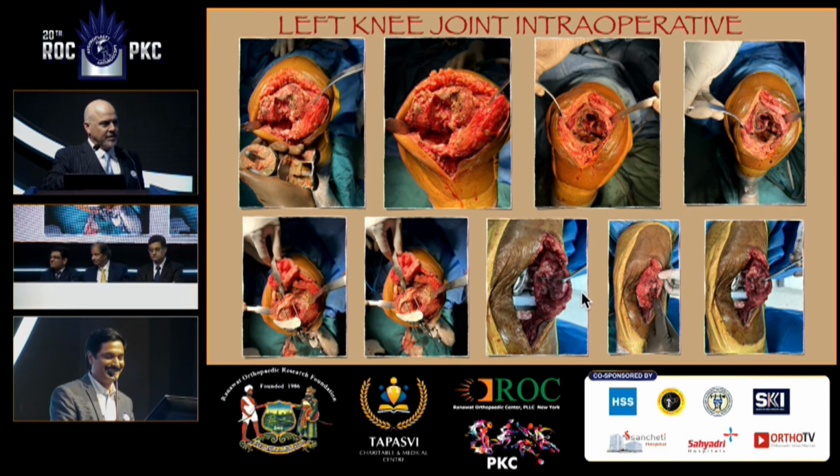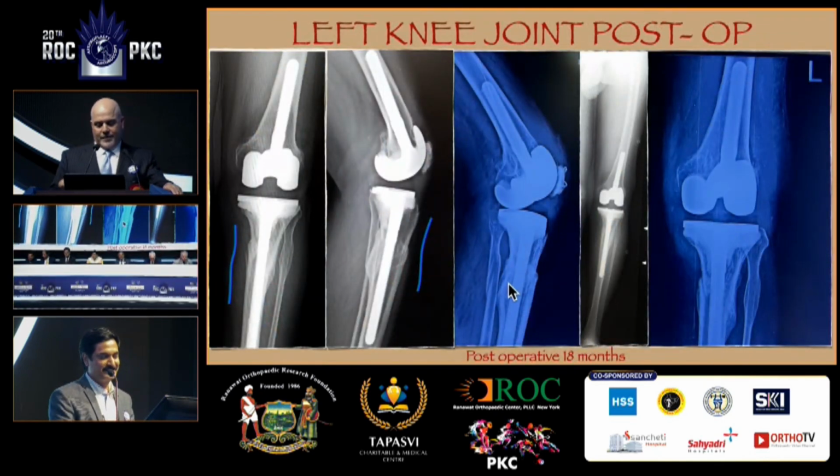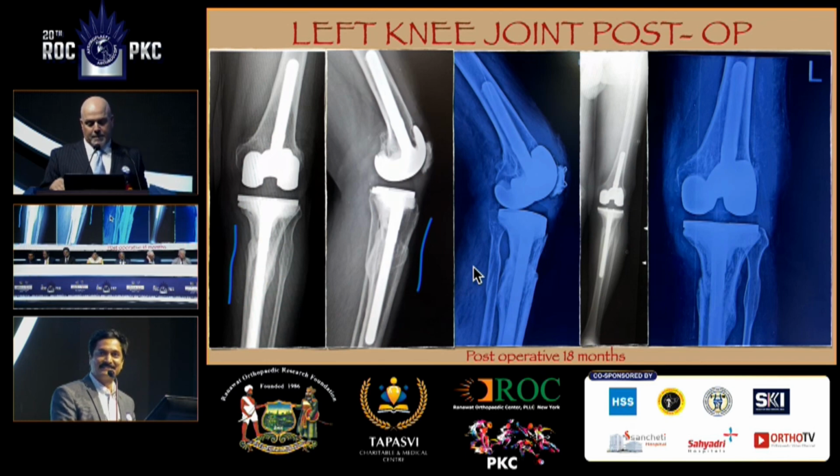Show me the fracture. Radiologically, you cannot see it. It's thinned out and fractured. Okay, now I see the radiologic wires, so I see it was fixed. All right, so how did you tackle the fracture in the tibia?